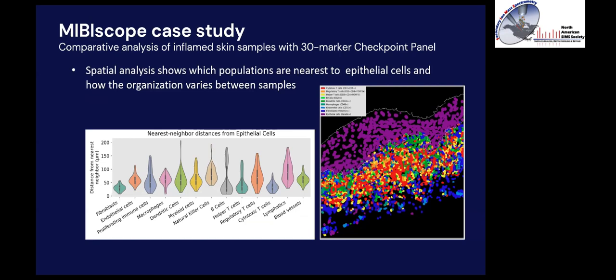And then finally, not only can we look at distributions of cells and expression, but because we have the spatial information, we know where each cell is. We can then start to look at where those cells are in relation to other features within the tissue image itself. And when I say features, that could be 2 different things. It could be where a cell of a particular population is, so let's say a tumor cell in relation to an immune cell, or we could look at higher level morphological features within the tissue sample itself, such as blood vessels or a tumor immune boundary.